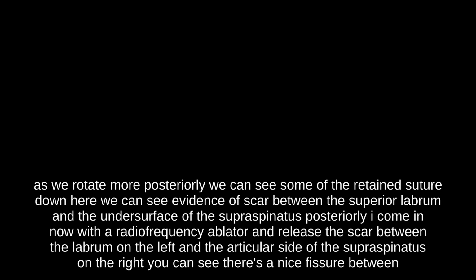I come in now with a radiofrequency ablator and release the scar between the labrum on the left and the articular side of the supraspinatus on the right. You can see there's a nice fissure between the two planes, between the rotator cuff on the right and the labrum on the left. By releasing this tissue, we'll be able to assess excursion of the rotator cuff.